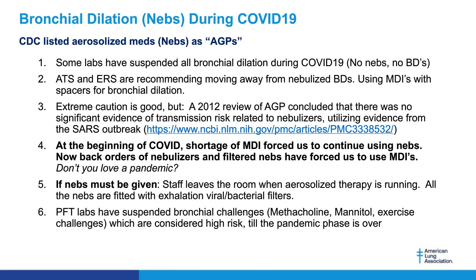Also, PFT labs have suspended all things like bronchial challenges, methacholine, and mannitol challenges. Mannitol is a type of bronchial challenge. Exercise challenges too. According to the American Thoracic Society, these are considered high risk, and we should hold off on these particular types of diagnostic exams until the pandemic phase is over.